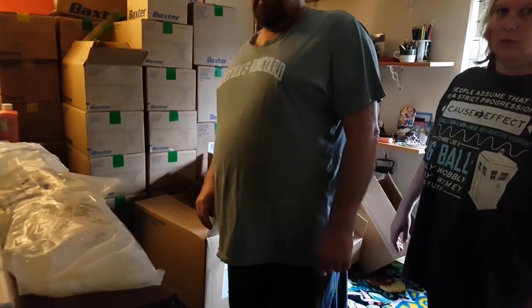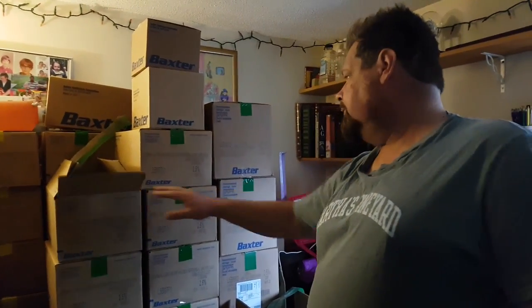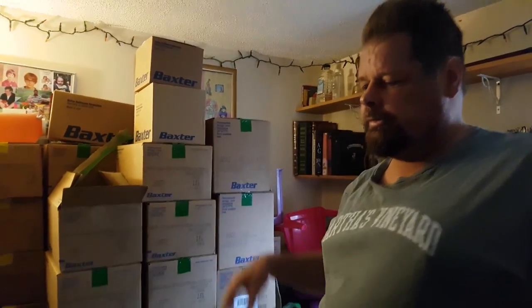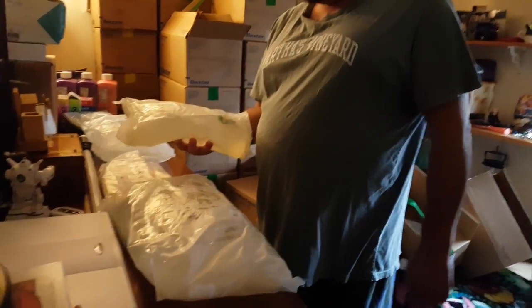So this is a recent delivery of, how long will this amount of... This is a monthly delivery of all the solutions. There's 2 6-liter bags in each box, and the larger box has 4 3-liter bags, and these are the size of the bags when they're full. Okay. So they're pretty big. I know you can't pick that up. Yeah, this one's pretty heavy.